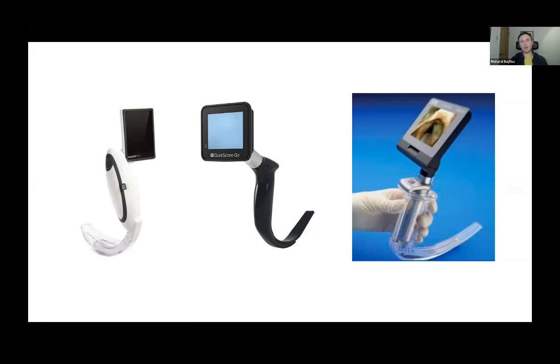The GlideScope Go is in the middle, so that's slightly pricier. The screen is £2,000, and that's about £25 per intubation. And the optics improve with the cost, really. So the GlideScope optics are better than the McGrath, and the CMAC obviously better than the GlideScope.